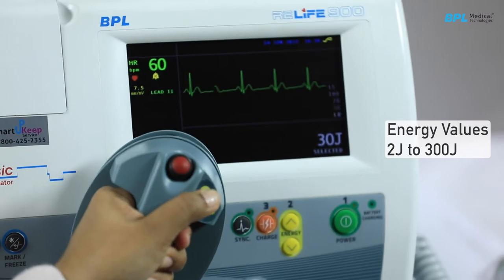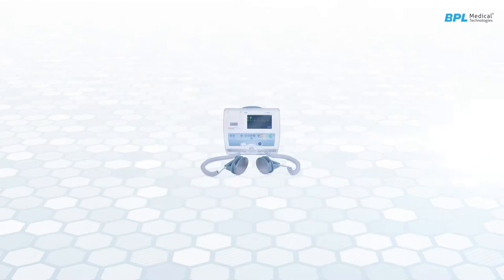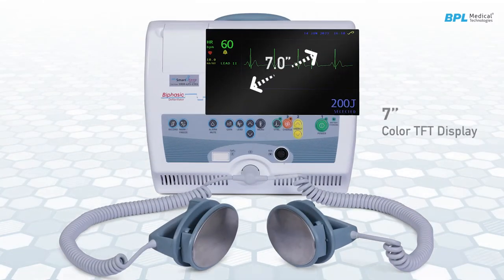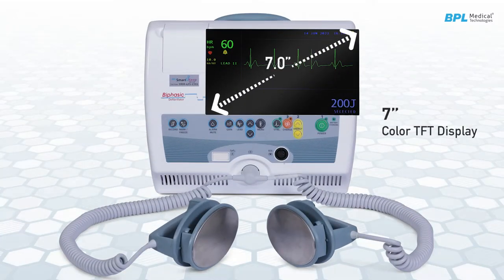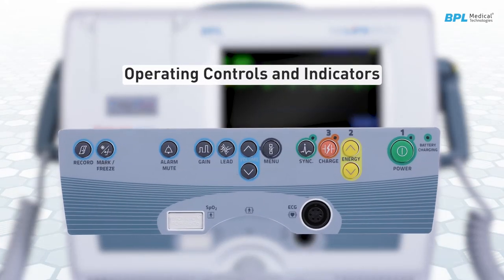The user can select energy values from 2 joules to 300 joules. The defibrillator has a 7-inch color TFT display. Let us look into the operational controls and indicators.